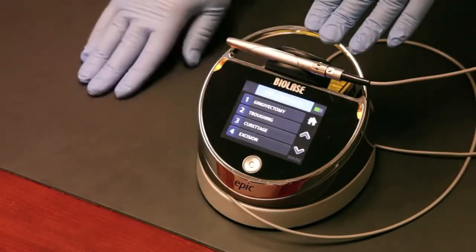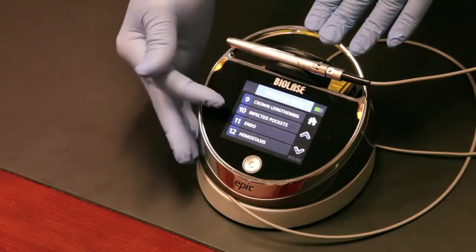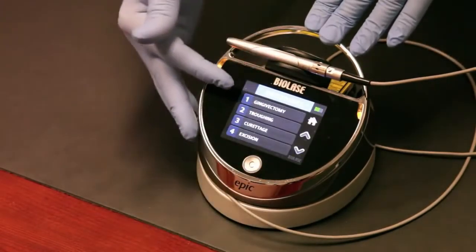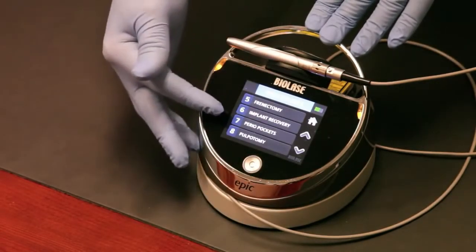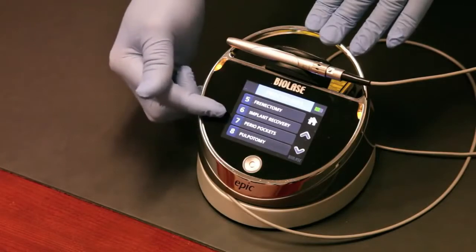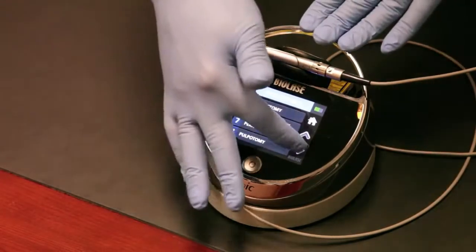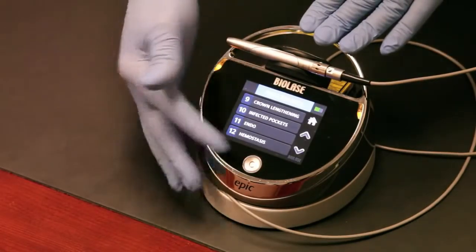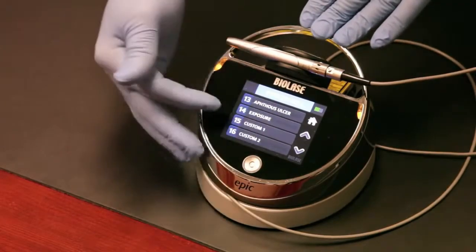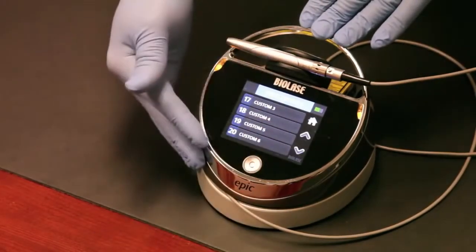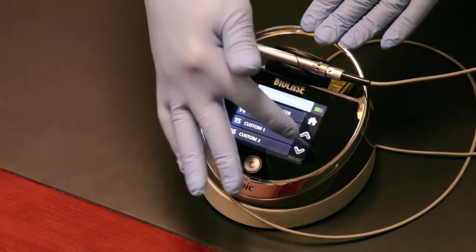You can quickly get into the soft tissue surgery, which is the majority of what you'll use your Epic laser for. You've got 14 presets that are factory loaded for very basic procedures. You can see procedures such as gingivectomy, troughing and curettage, excision, frenectomy, implant recovery, perio pockets which is a beautiful procedure for your hygiene team, crown lengthening, infected pockets, endo, hemostasis. There's a lot of procedures. In addition to the 14 presets, there's spots here for six of your own favorites, so up to 20 presets can be loaded into the Epic.